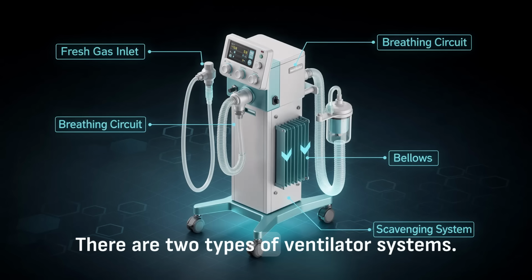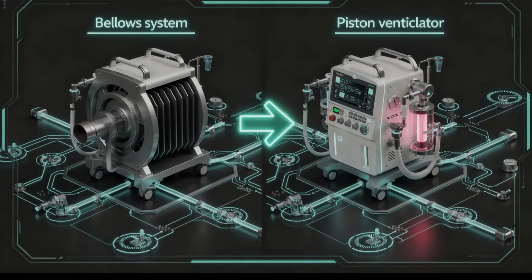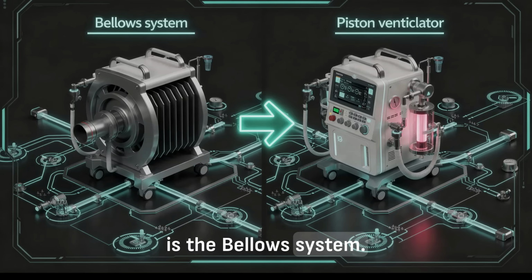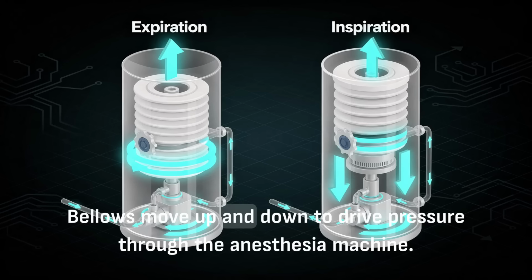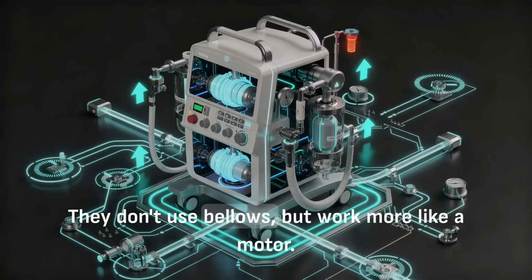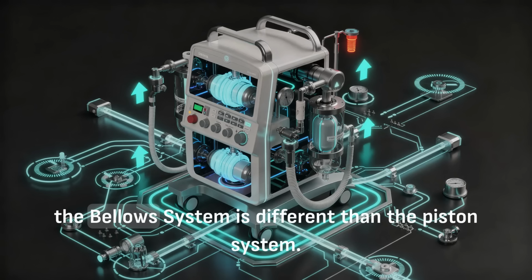There are two types of ventilator systems. The first type is the bellows system. Bellows move up and down to drive pressure through the anesthesia machine. Piston ventilators are mechanical. They don't use bellows, but work more like a motor. The bellows system is different than the piston system.